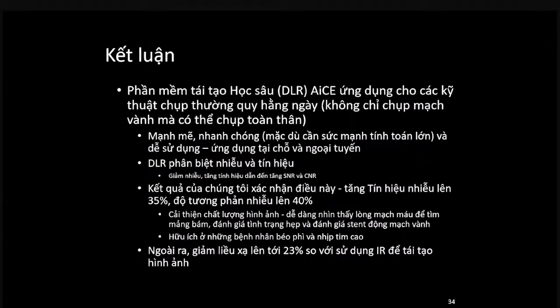So in conclusion, AICE deep learning reconstruction software can be used routinely during daily workload, not only for cardiac but also for body CT. It is robust, it's rapid, but huge computing power is needed, and easily used because it is on-site and offline. Deep learning reconstruction software is able to differentiate between noise and signal, so it reduces noise and increases signal, and so increases signal to noise ratio and contrast to noise ratio.